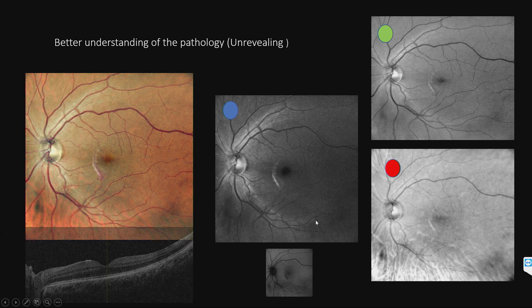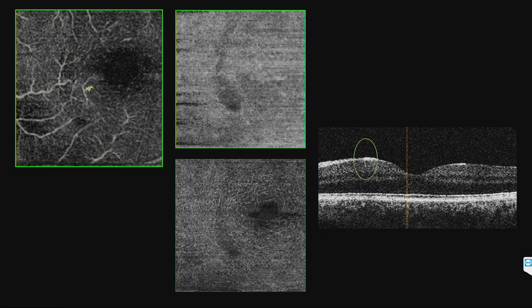Now we know it's an anterior retinal problem. An OCTA was done and you can see that there is a rupture of the superficial and deep capillary plexus, along with an OCT showing a vertical cleavage plane at the anterior retinal surface. This is a rare occurrence with blunt trauma — an anterior retinal rupture rather than a choroidal rupture.